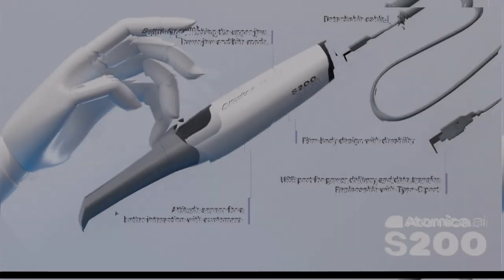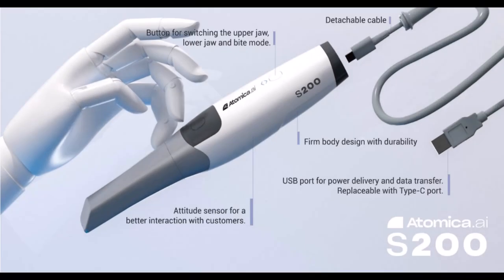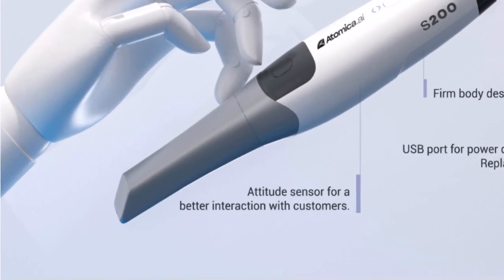First, let's start by exploring the scanner's components, starting with the scanner removable tips. It comes with two different size tips that fit different needs.